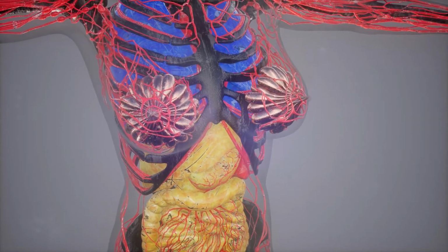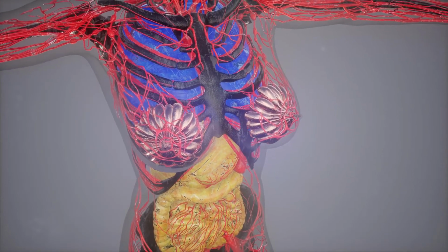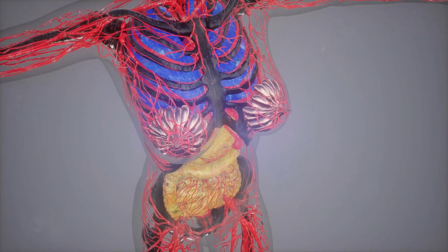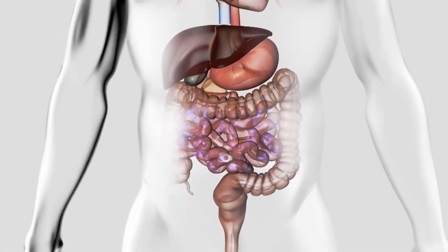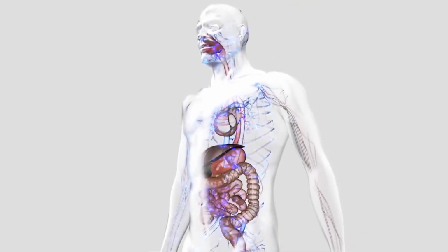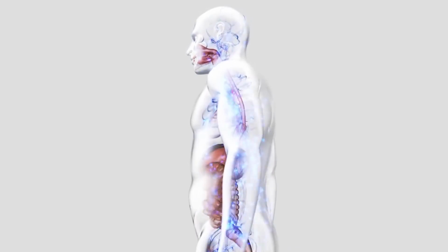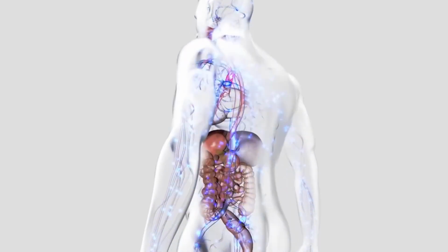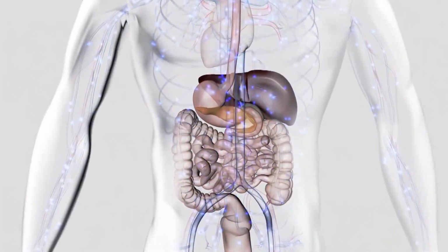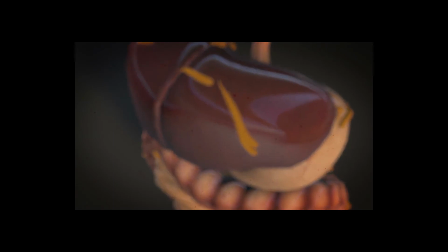Laparoscopy is a type of endoscopy test performed in the abdominal or pelvic area. To insert the scope into the body, a doctor makes a small cut in the abdominal area and threads the scope through the incision. A patient is usually put under general anesthesia during the test. A laparoscopy can be performed to examine the appendix or gallbladder or to diagnose cysts or cancers in the reproductive system, such as ovarian cysts or cancer. The test can also be performed to diagnose endometriosis or an ectopic pregnancy.